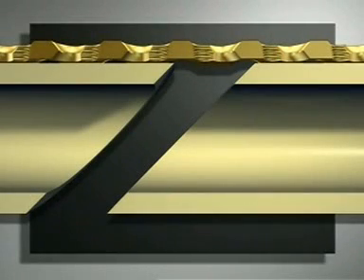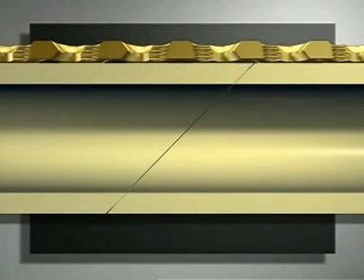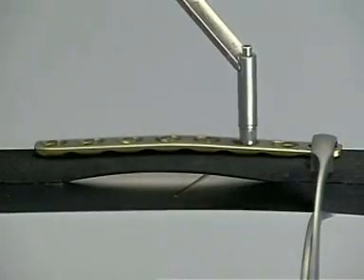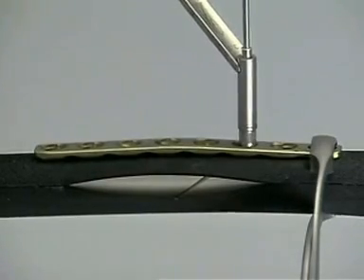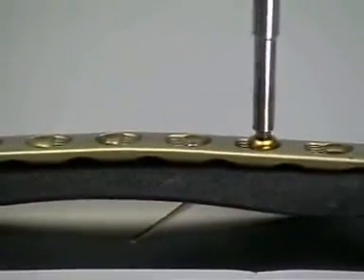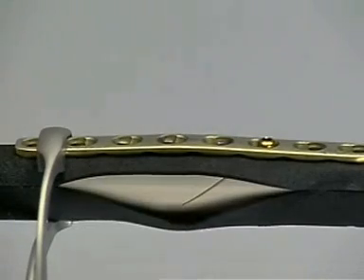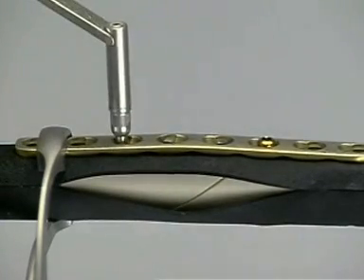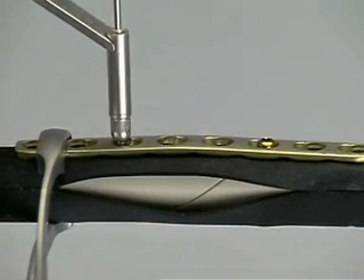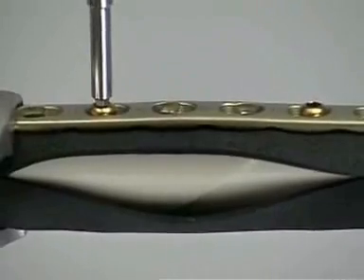To prevent gliding along the oblique fracture plane, the fragment forming an open angle to the plate must first be fixed in place, then the sharp edge of the second fragment will be wedged in for optimal axial compression. A hole is drilled in the neutral position with the 3.2 mm drill bit and the universal drill guide; the length is measured. After tapping, the screw is inserted and tightened. The reduction is verified. To compress the fracture, the plate is fixed to the other bone segment with an eccentrically placed screw. A hole is drilled in the eccentric position, the length is measured, the hole is tapped, and the screw is inserted and tightened. Axial compression of the fracture is obtained.